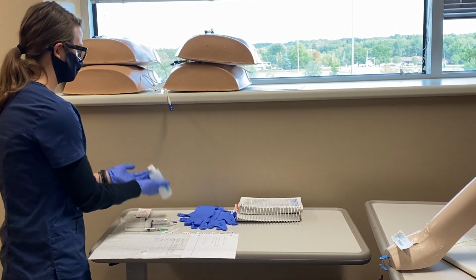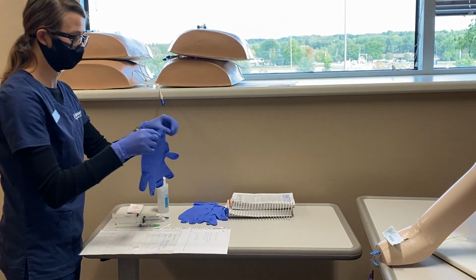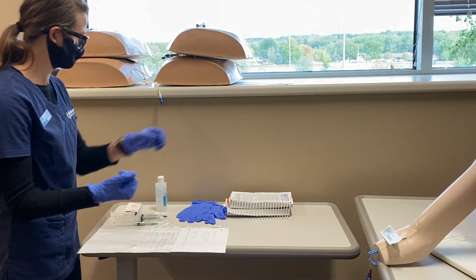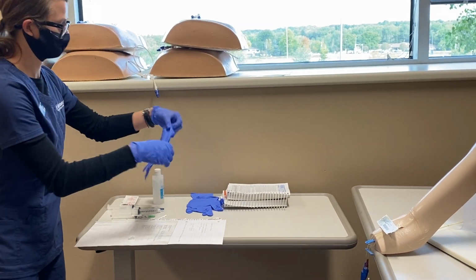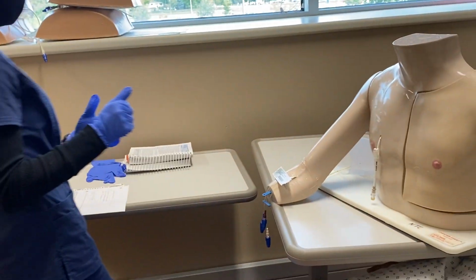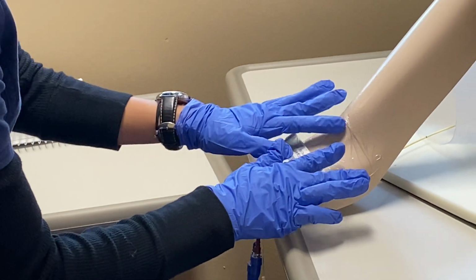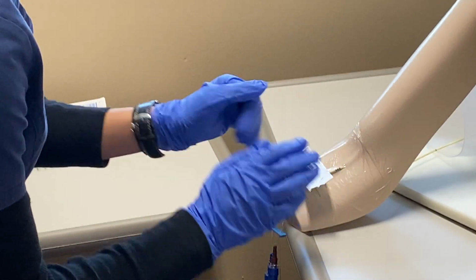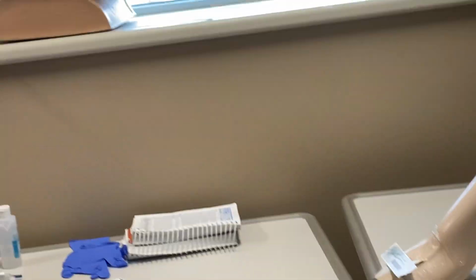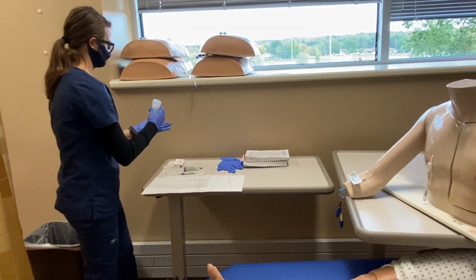So I'm going to go ahead and just wash my hands. And I'm going to be assessing that IV site. I'm just looking to make sure that it's not infiltrating, if there's no infection, and that it doesn't look like it may be displaced. It doesn't, so we're going to go ahead and use it. I'm going to take off my gloves and wash my hands.